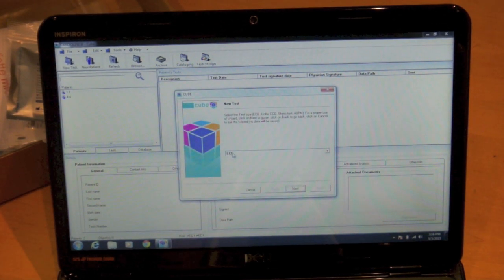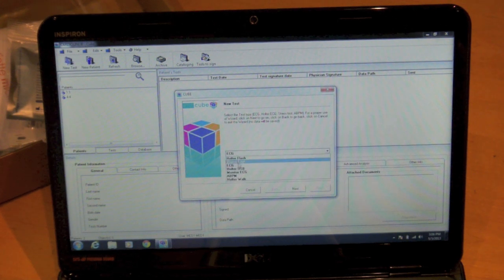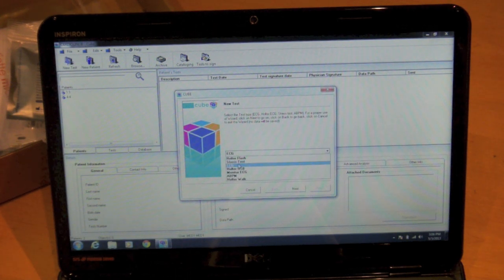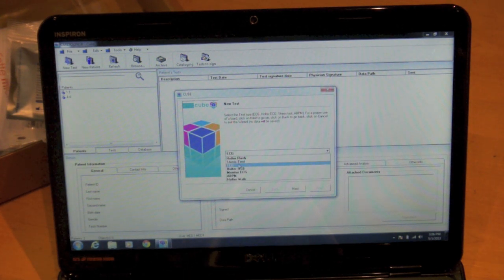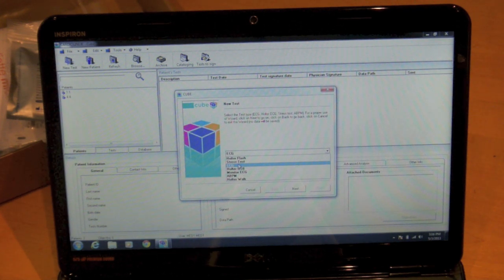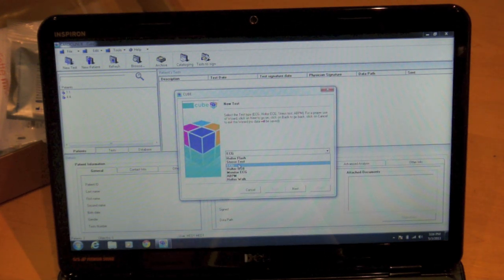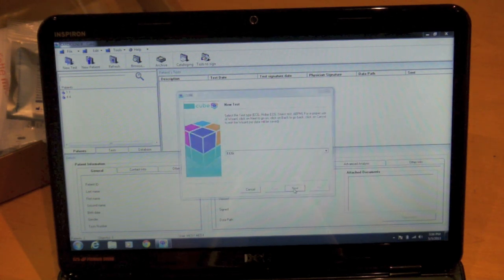It's going to ask me what type of test it is. This particular software does support all of Cardioline's diagnostic equipment including Holter, Stress, 24-hour ABP. So we'll go ahead and do an EKG test which is what the Microtel is.